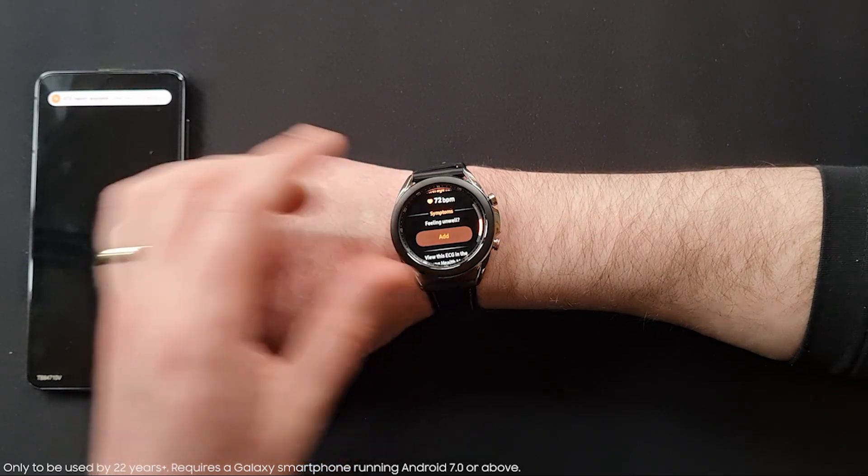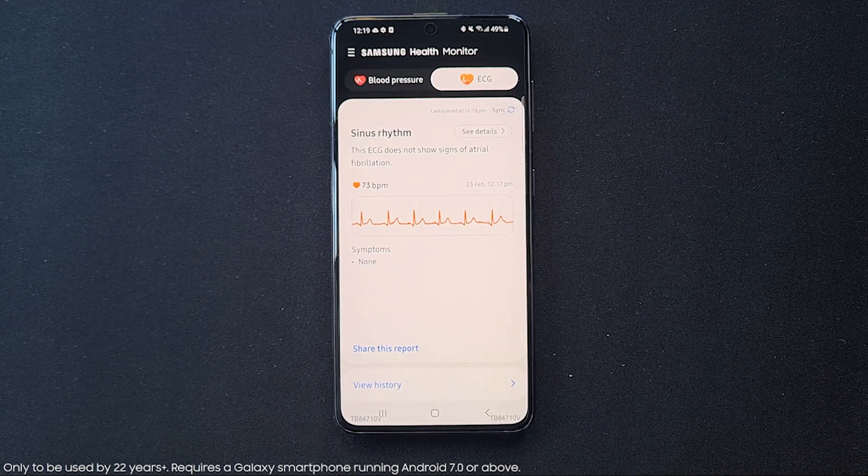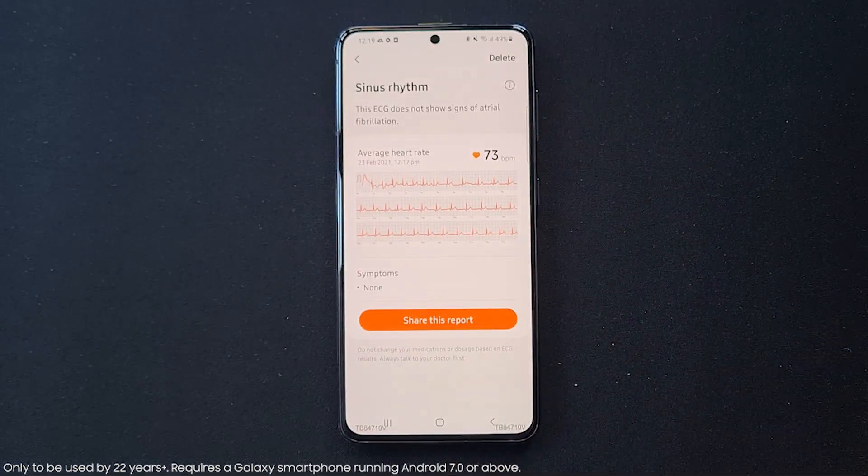Crikey, hope this gives me a good ECG report! Once the ECG is completed, an ECG report will pop up on your phone and you can measure and analyse your heart rhythm.